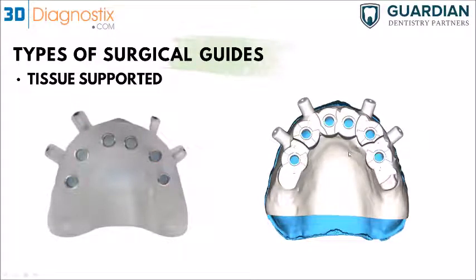So when you go in, you need to make sure the kit or the drills you use have the physical stoppers hit the top of the sleeve. But it's just going to have the same fit of the denture. So this is why I've mentioned before that it's really important to make sure that the denture is seated well in the tissue, because in the end, the surgical guide is going to have the same seating, or the same intaglio, as the denture. And this is how it looks after printing it, of course.